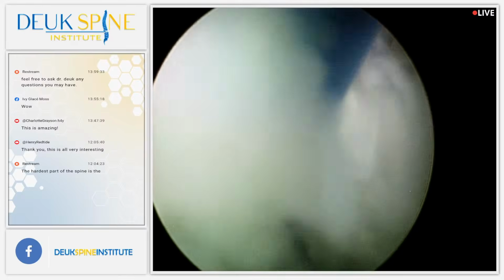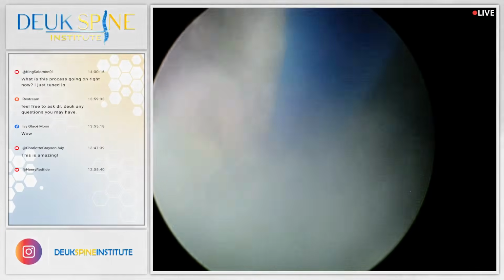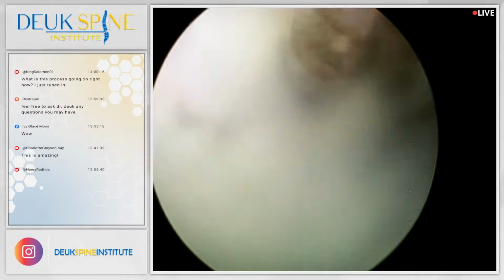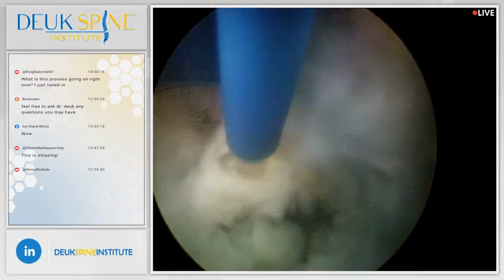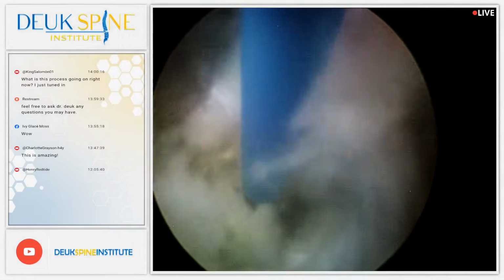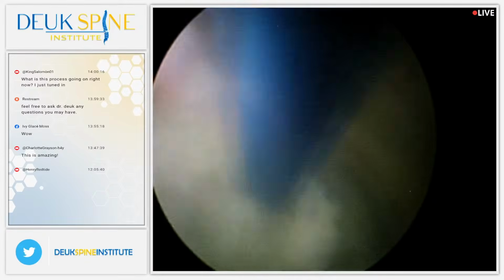All right. Any of our viewers have questions about what we're doing, why we're doing it? We showed them the 30 causes of chronic back pain, right? Yes, we have. We've shown them how disc injuries cause back pain. Now let's show them how we fix these disc injuries using the laser endoscopically. Okay.